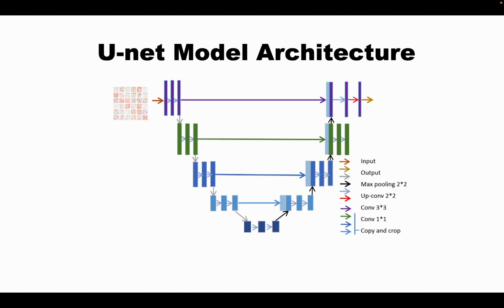The UNet architecture involves a contracting functional block, or encoder, and an expansive functional block, the decoder. The contracting path looks like a simple CNN architectural design that comprises several convolutional and pooling layers. Each contracting path block, like all the others, generally has 2 3x3 convolutions followed by a rectified linear unit activation function, and max pooling with window subsampling size 2x2.